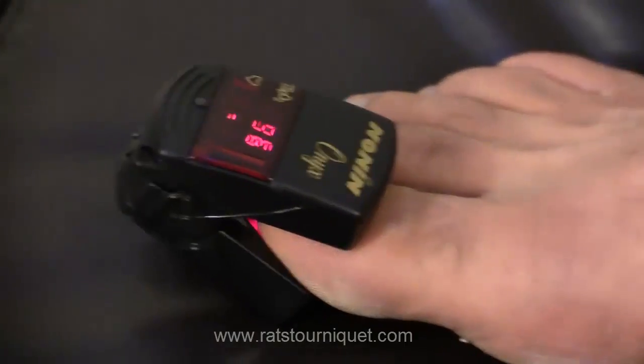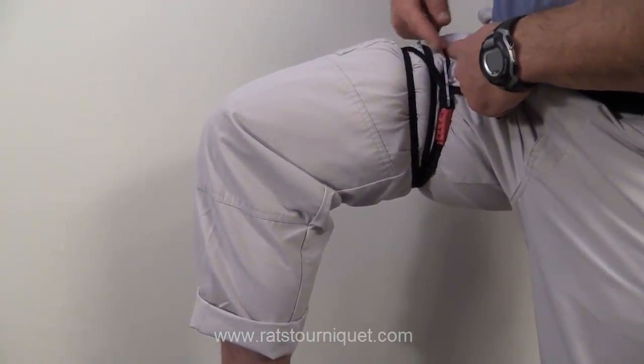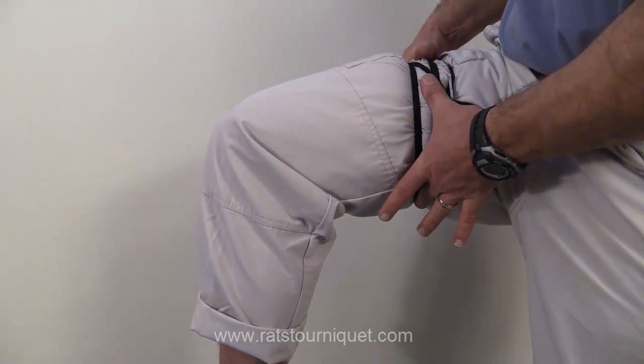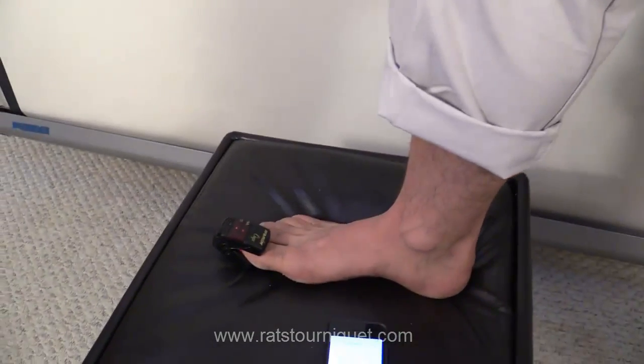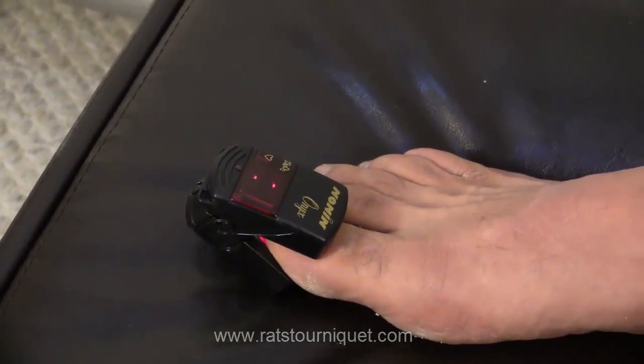The RATS tourniquet — if you look up here, you can see that we have the desired amount of inch and a half to two to three inches of compression of tissue around the area needed to stop blood flow. If you look again at the Pulse Ox, you can see that oxygen is now stopped on the foot. The Rapid Application Tourniquet.